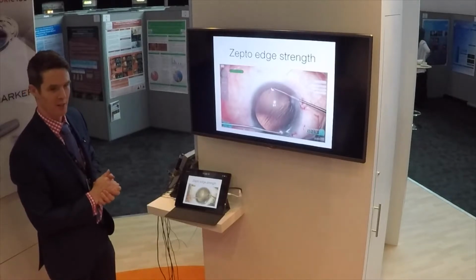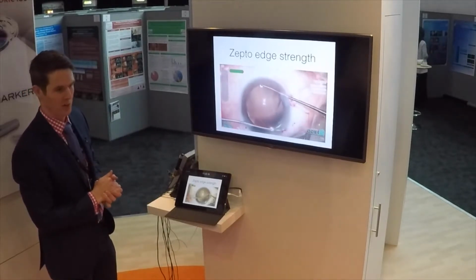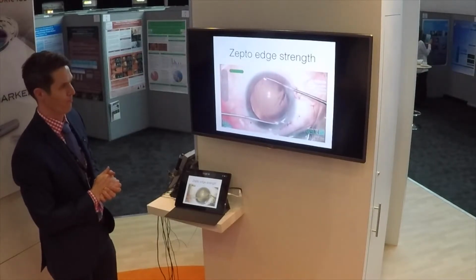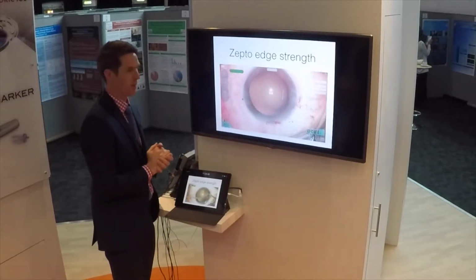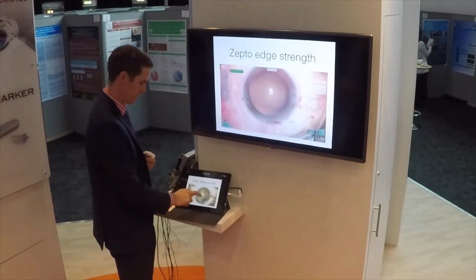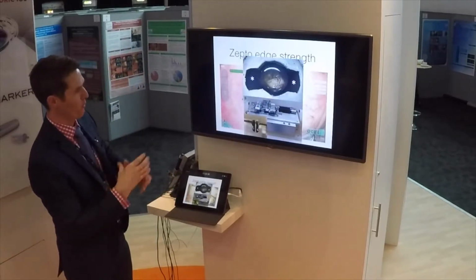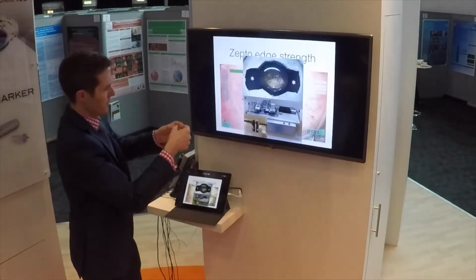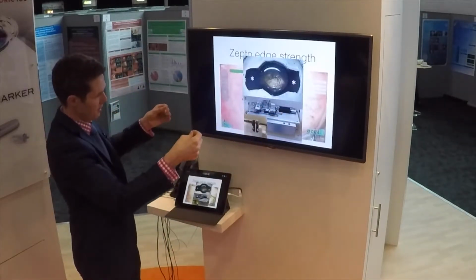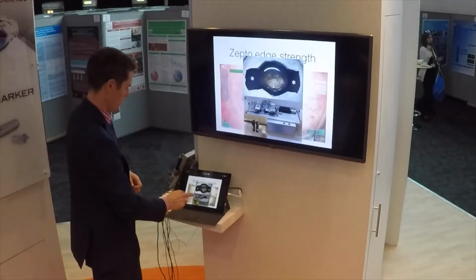Pretty strong, I would say. I don't think anyone would do that on their rhexis otherwise. So nice and circular, a constant opening of 5.2 millimeters in breadth. This was testing the strength in the lab with this instrument, which is calibrated to pull the rhexis in a transverse fashion to test the strength of the capsulorhexis.